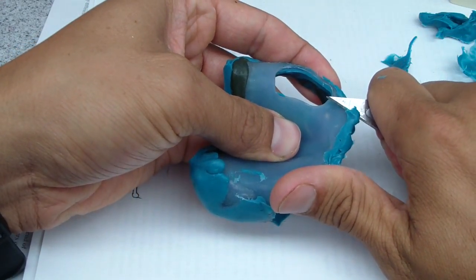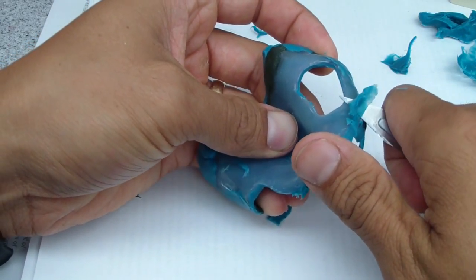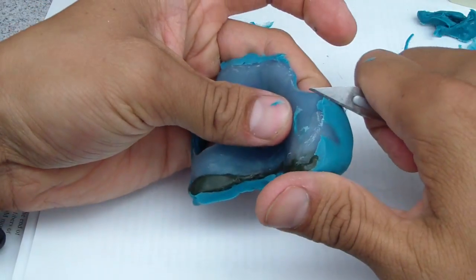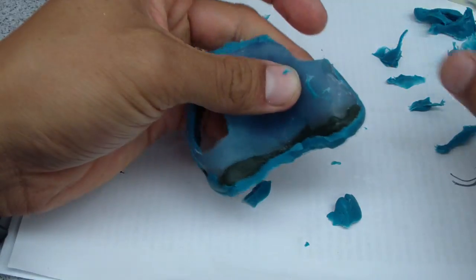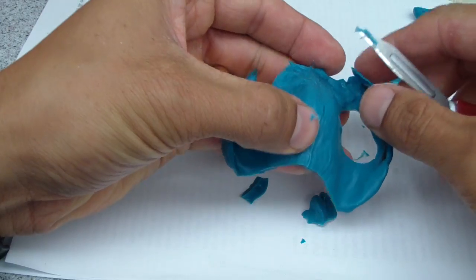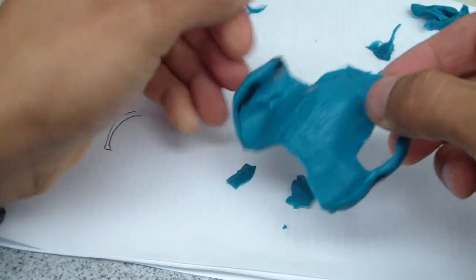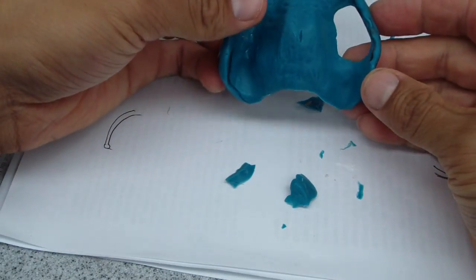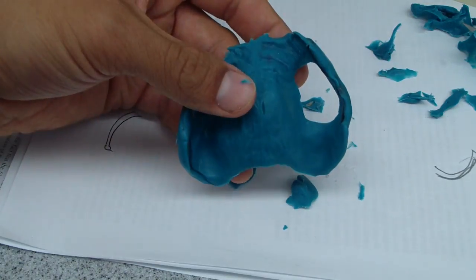And now what we're going to do is we're going to place alginate adhesive on the cameo surface of this custom tray, and then, again, like I said, we'll pick that up with an alginate impression and see that just afterwards. Just trying to remove all this polyvinyl to make sure we've got something to adhere to. Okay, there we go.